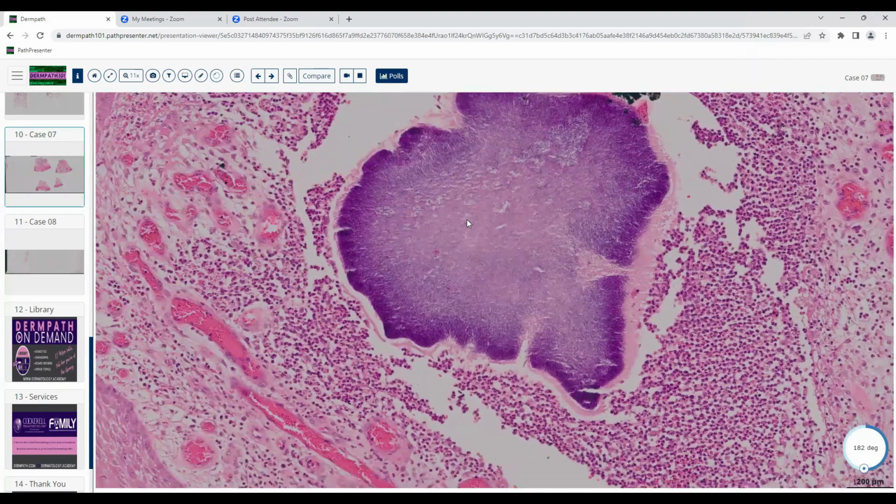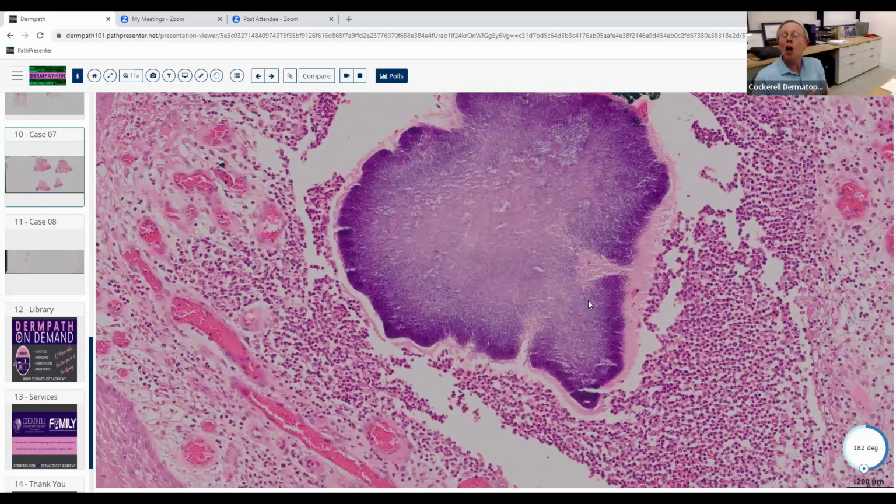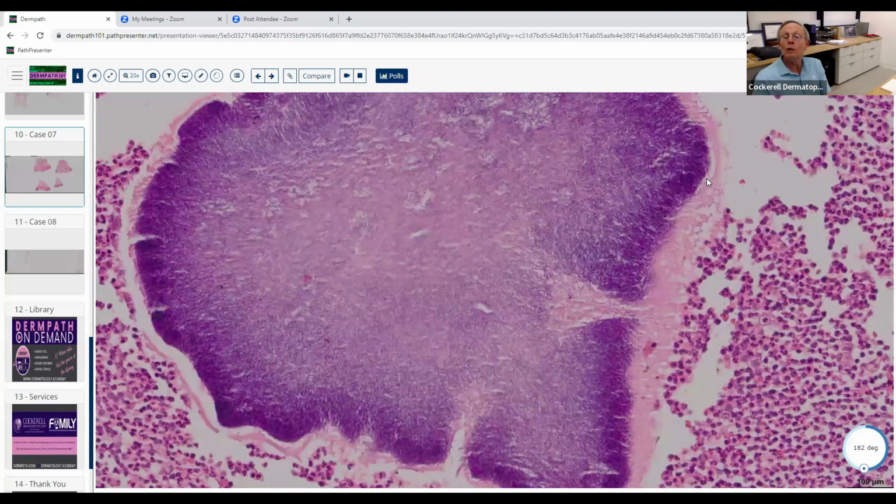I'm not really sure what the last one is. Nocardia. That's right. So those are the grains. There's not a zillion of them. There's only about 4 or 5. So then you have to decide, well, which one is it? If you're going to choose from those, which one are you going to choose?